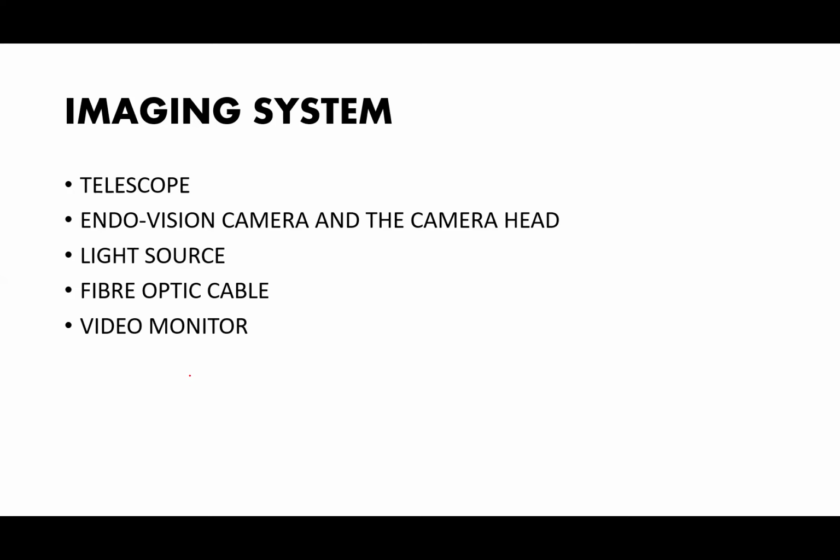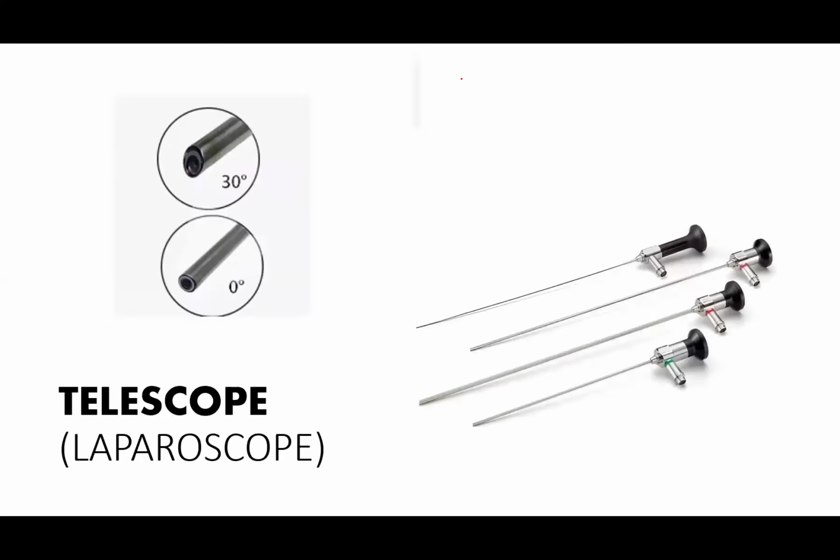Light source, fiber optic cable, and the video monitor. These form the components of the imaging system of a laparoscopic equipment.